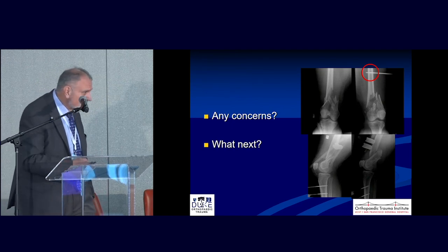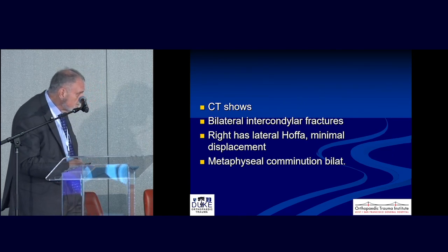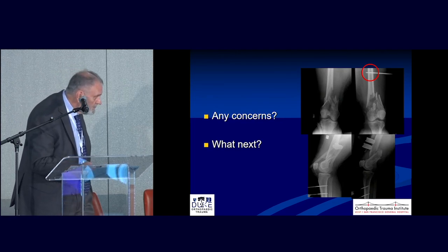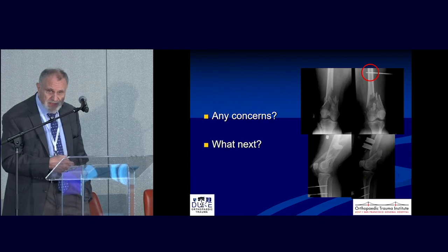Okay, all right, so we like that so far, so we're not throwing too many tomatoes. Go back to the film there, where you've got your tibial pins A to P, right? And femur pins are lateral. Lateral, right. That's a problem potentially. That's not the way I would do it. How would you do it? I put my femur pins in A to P and the tibial pins.